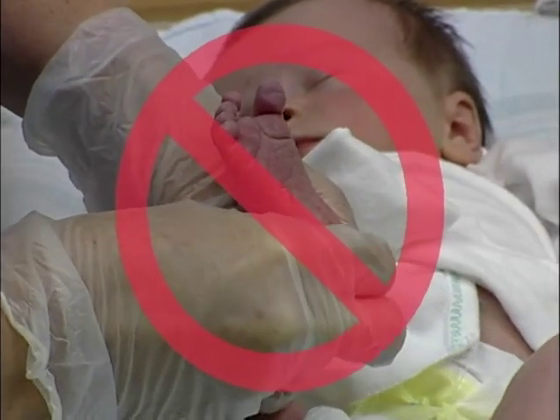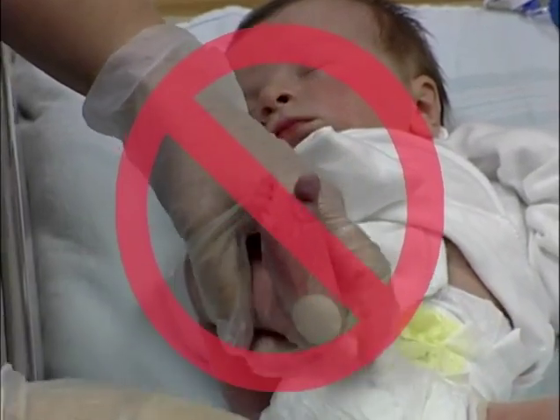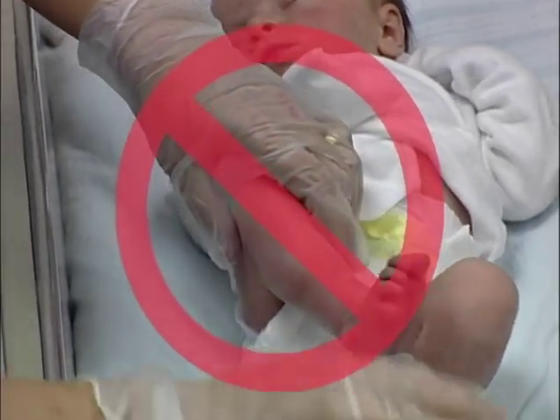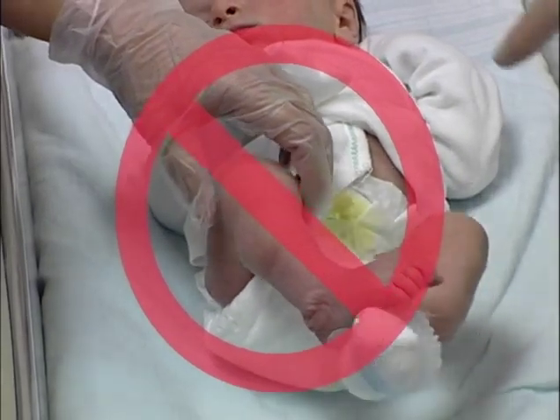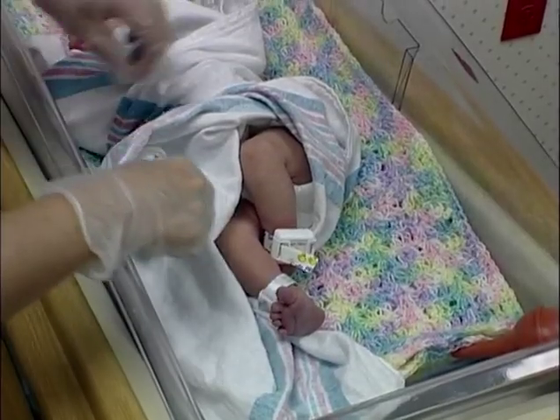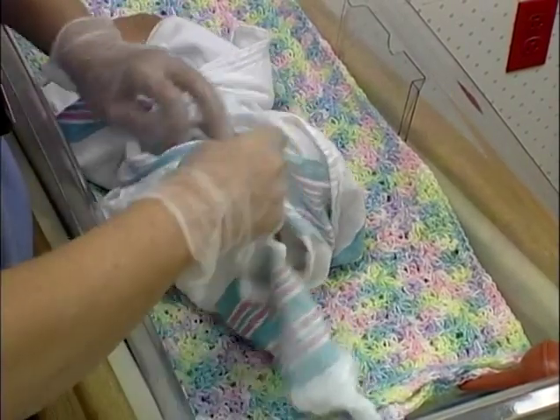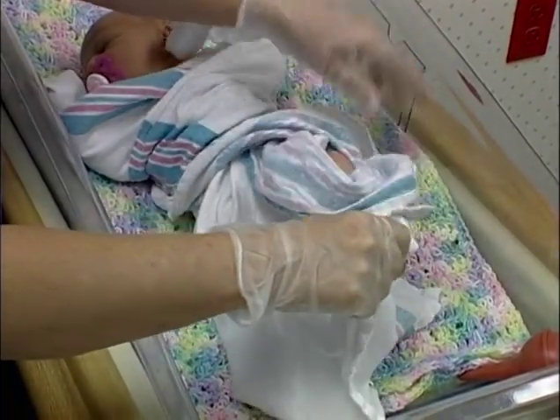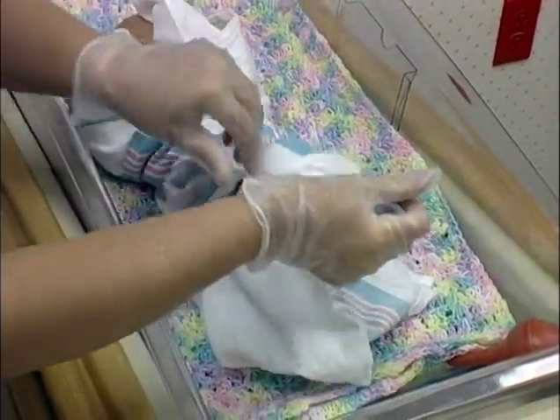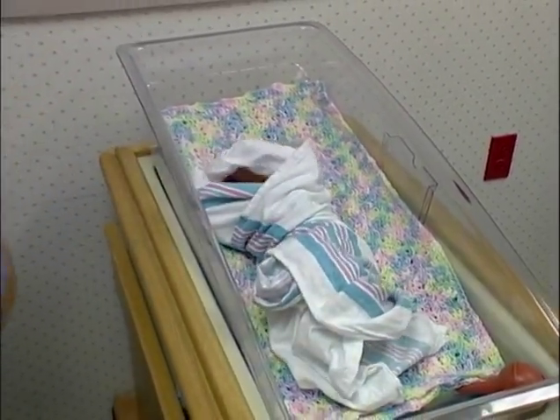CLSI cautions against bandaging the heels of infants since adhesives threaten the integrity of delicate neonatal skin. Bandages also pose a choking hazard to the infant. Inspect the collection area, especially infant cribs and car seats, for supplies and equipment that might also pose a choking hazard. AARC suggests transporting the specimen on ice if testing will be delayed beyond 15 minutes.